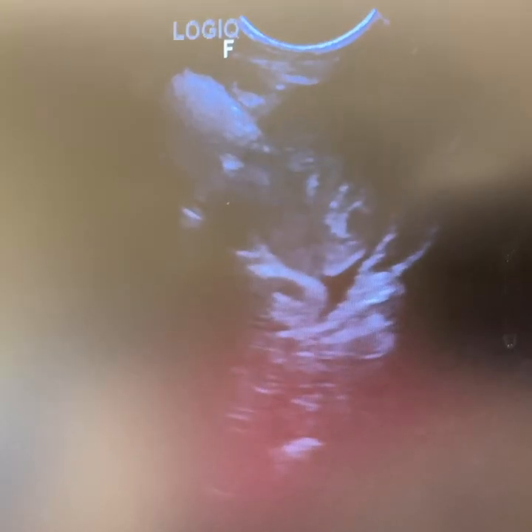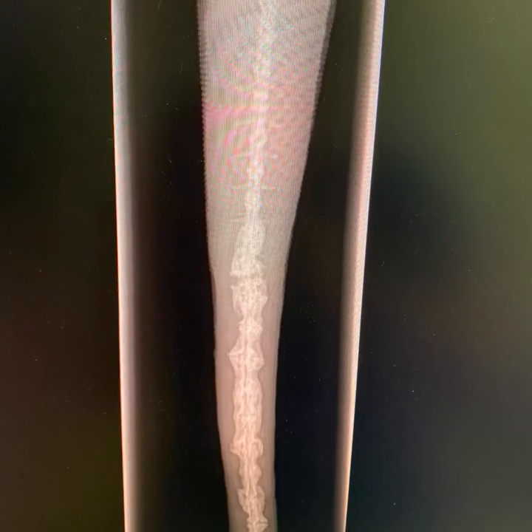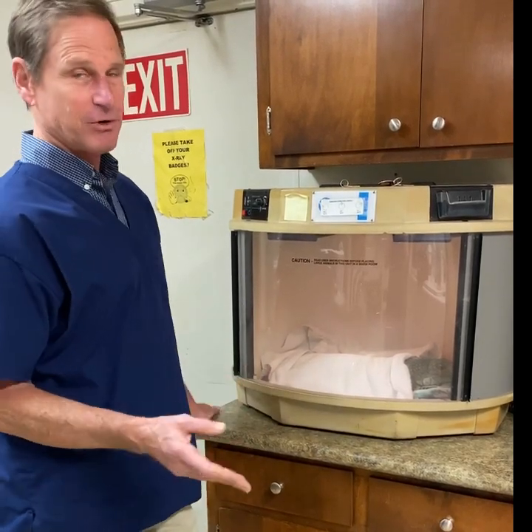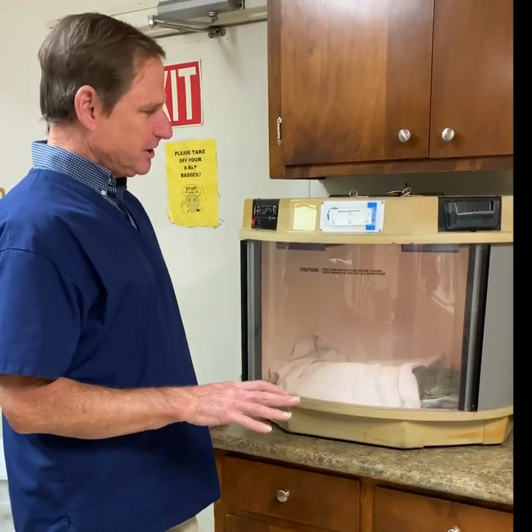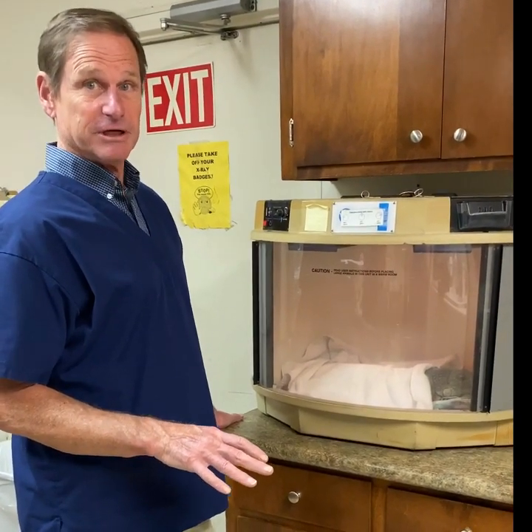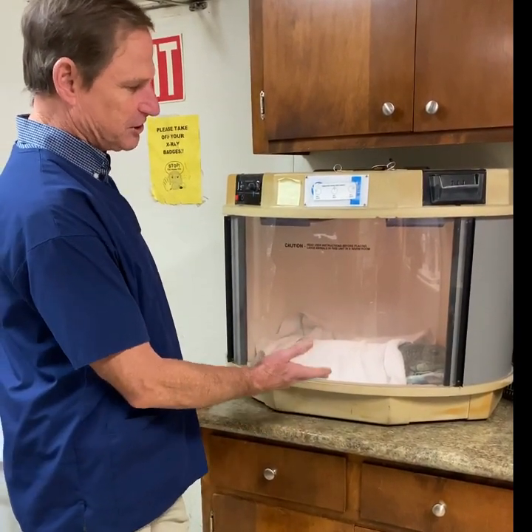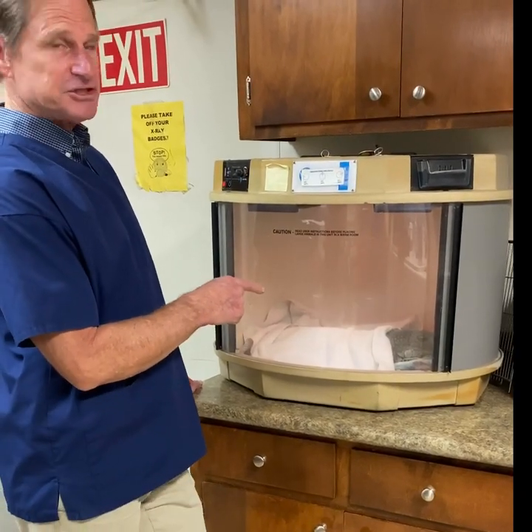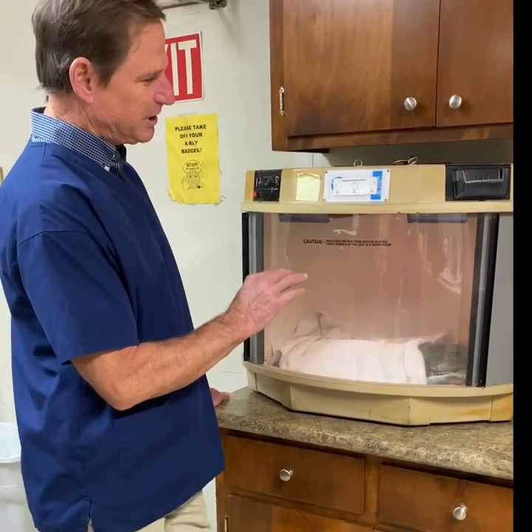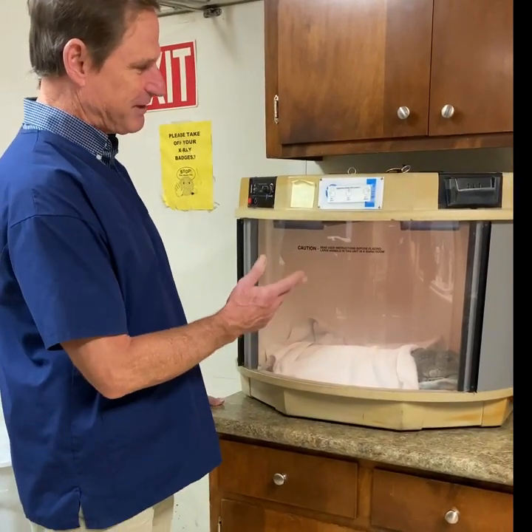We're in the incubator now. It's always important — and I forgot to mention this during the surgery — to keep these patients warm. As we know, reptiles don't make their own heat, so they won't wake up well if we don't keep them warm during recovery. The incubator is doing that, and we also have heating discs underneath the towels so the heat will rise up and trap in the blanket to keep her even warmer. The tube is still in place; she's breathing well on her own, but we leave the tube in until she really shows motion, just in case — in this case she'll have the tube out in a few minutes.